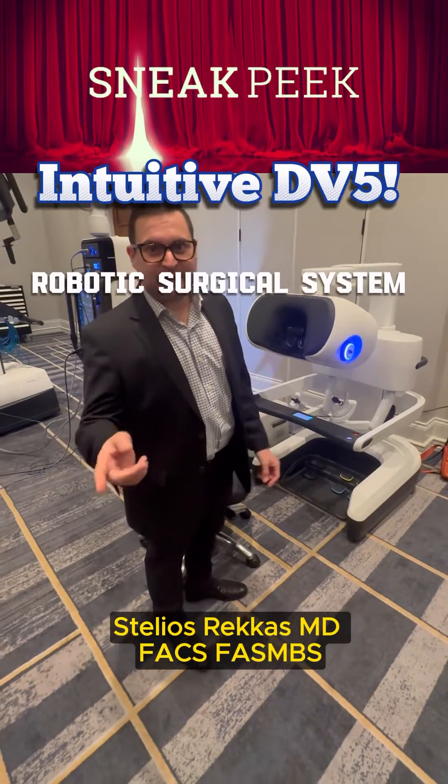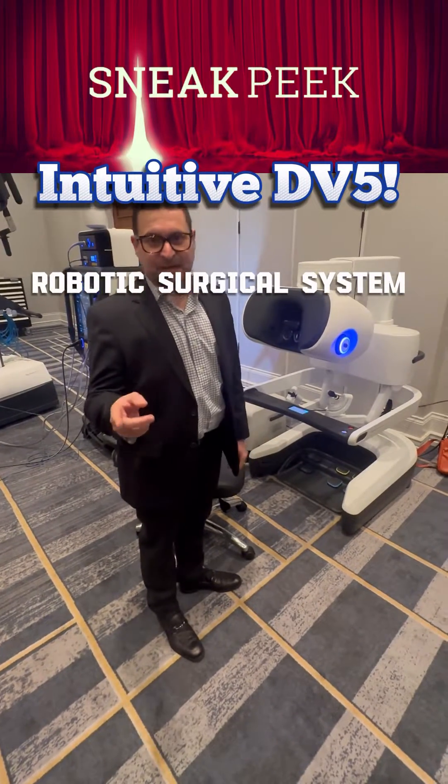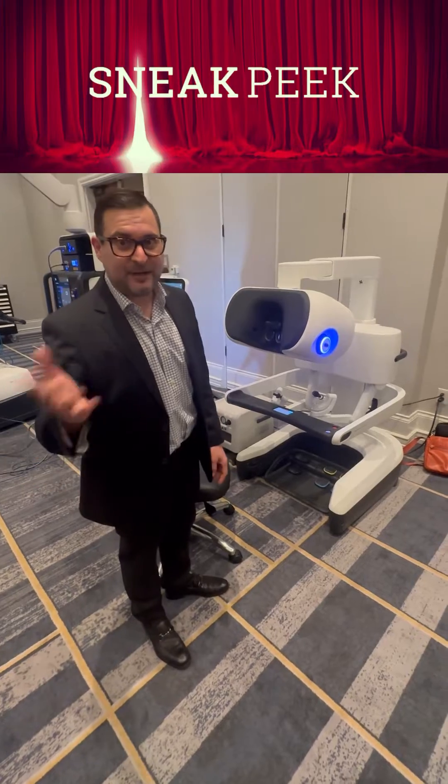I'm Dr. Reckes. I want to show you guys something very exciting. The new robot from Intuitive got FDA cleared last week and we're going to have early access to it.